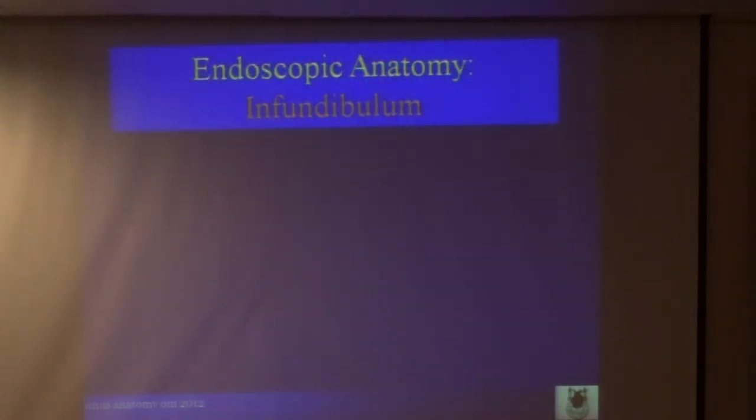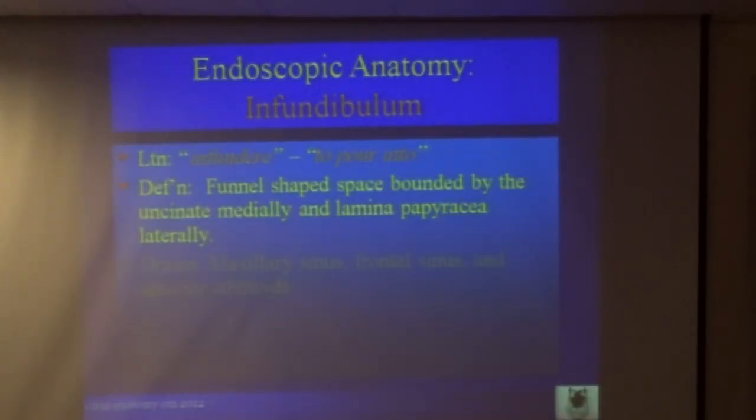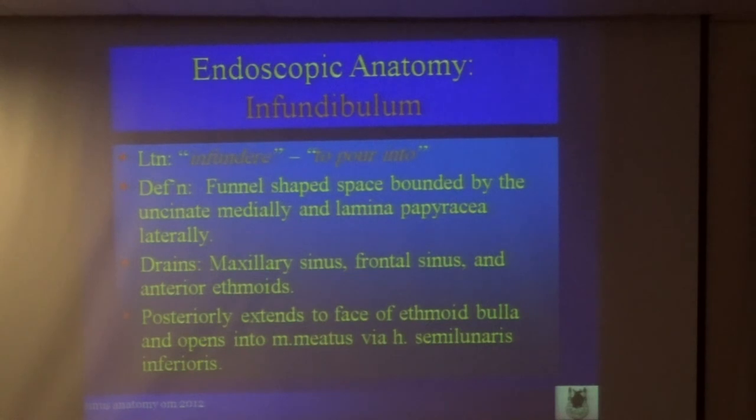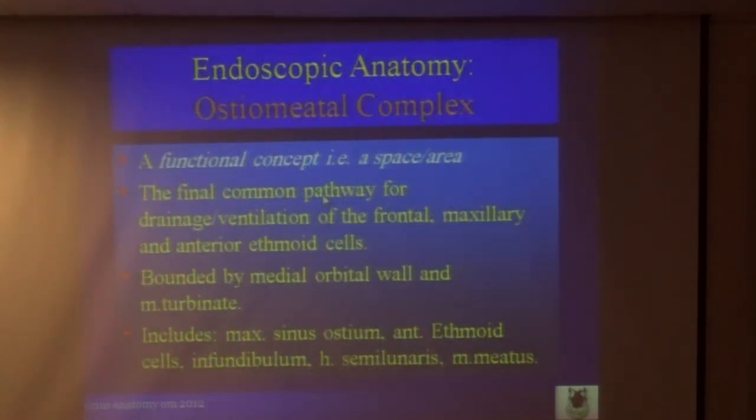It was given to me by Dr. Amin Jafar for approval. The infundibulum is funnel-shaped, bounded by the uncinate process and lamina papyracea, and it drains the maxillary sinus, the frontal sinus, and the anterior ethmoid. So this is the ethmoid infundibulum, which is very critical to recognize and know.